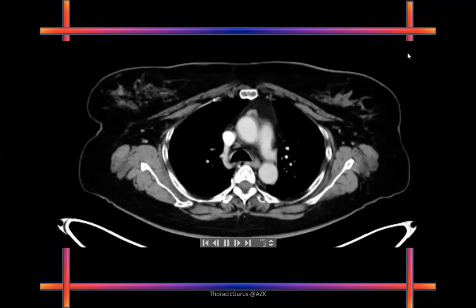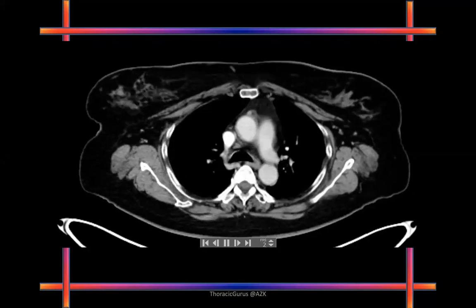What's happening? Pitun, what's happening? Oh, okay. So now we are seeing the contrast draining into the SVC. Very good. Excellent. Everybody happy with this? Very clear. Okay. Continue looking at the SVC.